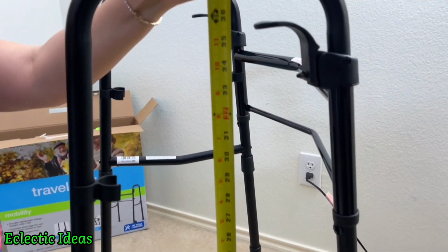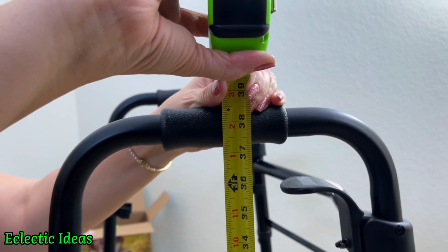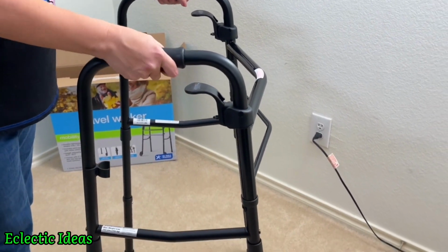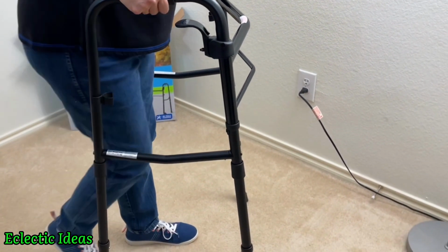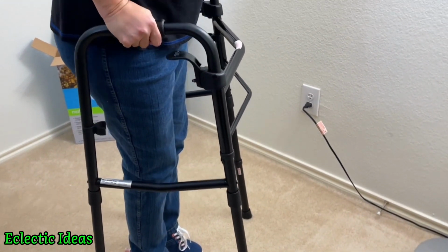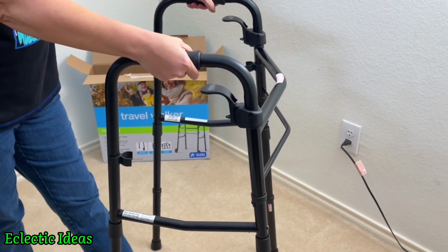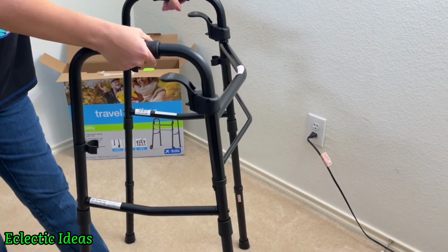And just in case you can't see it, because presbyopia is a thing, right? We're telling you it's 38.5 inches tall. Now at the full height extension, it does feel kind of wobbly to me, but if you were tall enough to need it fully extended, probably the fact that you would be pushing down on the handlebars at the correct angle would stabilize it. And a lot of us won't need it at this full extension because we're far shorter than that.